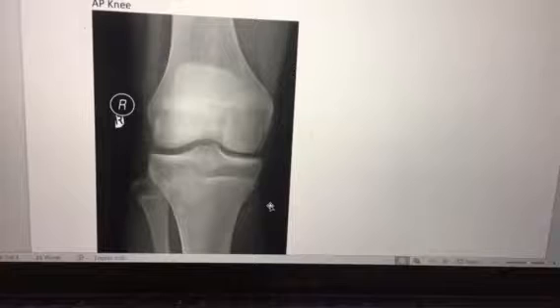Okay, so for my knee trauma series, I did an AP, I did a lateral, and then I did an oblique with medial rotation. I also did Béclère and the Settegast methods. So for my AP knee, your central ray would come in 1 inch inferior to the patellar apex, and you would angle just depending on the centimeter of your patient.